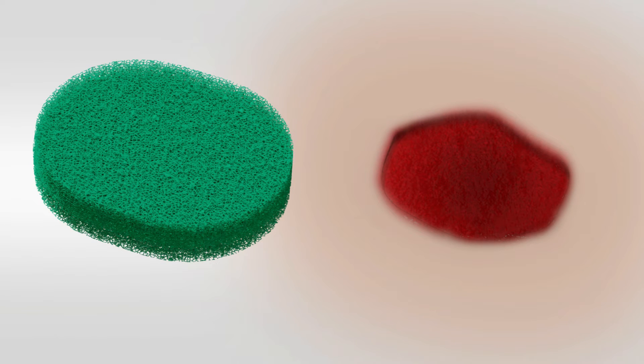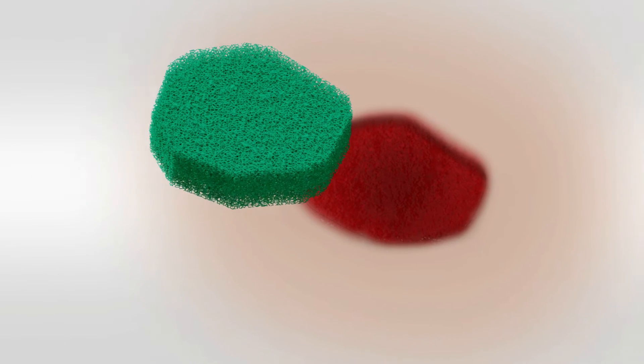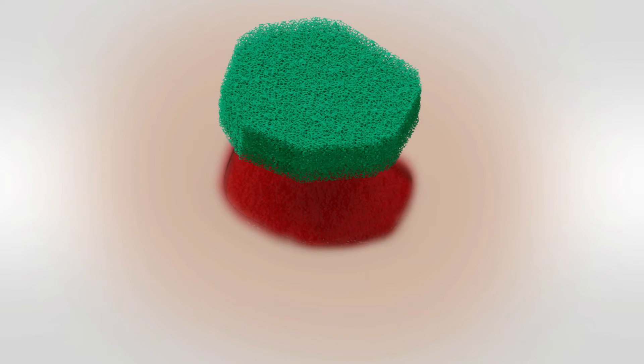Before applying the dressing, cleanse the wound and surrounding skin, taking care to dry the skin around the wound. To fill the wound cavity, while keeping a distance from the wound to ensure no fragments can fall into the wound, cut the Avant Solo Adapt Foam to the shape of the wound, such that it will fit into the cavity without overlapping the skin surrounding the wound.